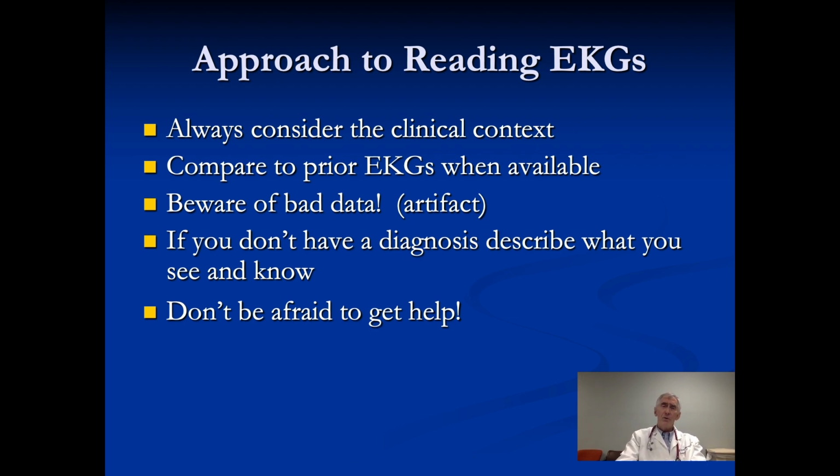In addition to the systematic approach, you want to consider the clinical context. So whenever possible, find out the information about the patient when you are about to read it. If not, sometimes you're just faced with the EKG by itself. Find an old EKG is the third commandment, so that you can compare any changes that might be abnormal with a previous EKG that may show the same abnormality.